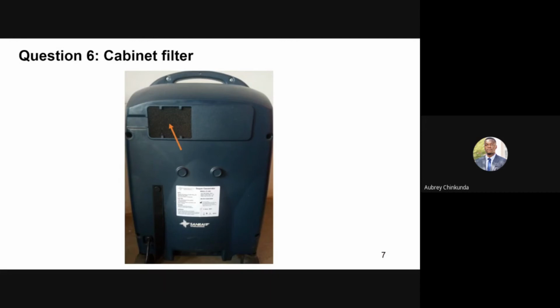Hence, running the oxygen concentrator without the cabinet filters may result in quick collection of dirt in the intake filter. And once the intake filter is clogged with large particles, it will have the following effects. Firstly, the pressure can be affected, which may end up affecting the purity of the oxygen that is being delivered to the patient. The lifespan of the intake filter will also be shortened, thereby increasing maintenance costs.